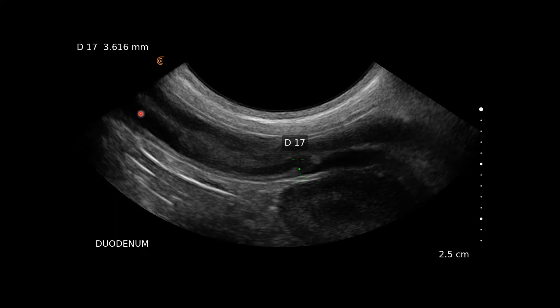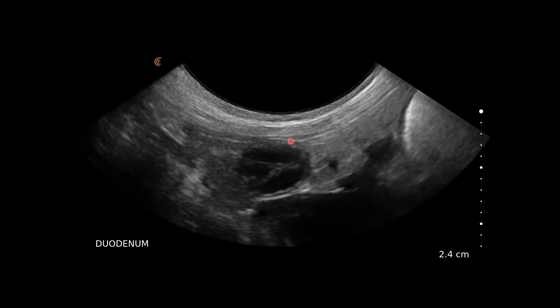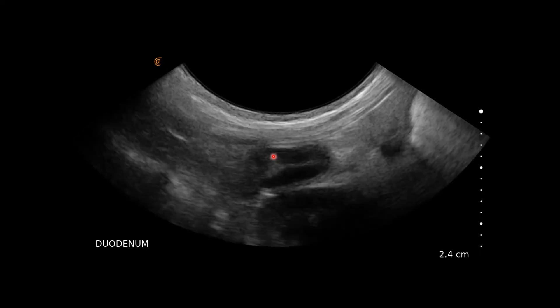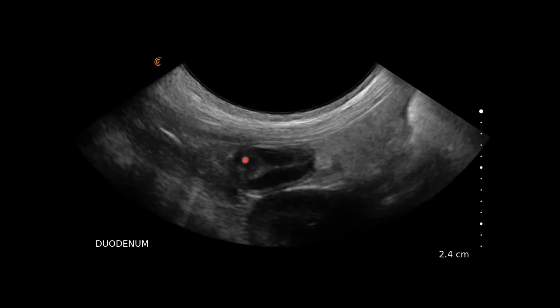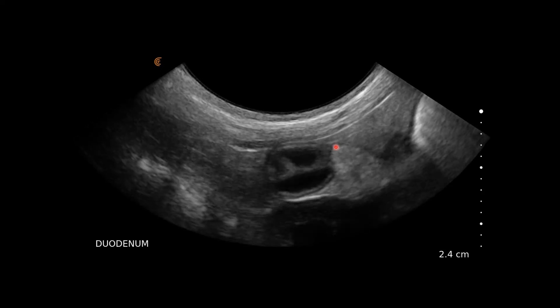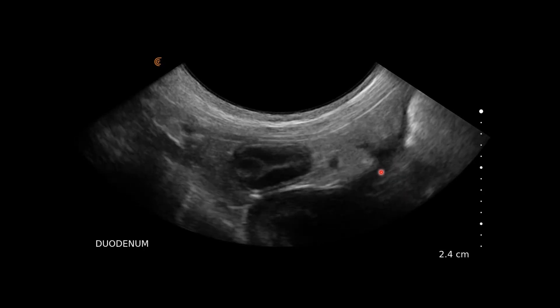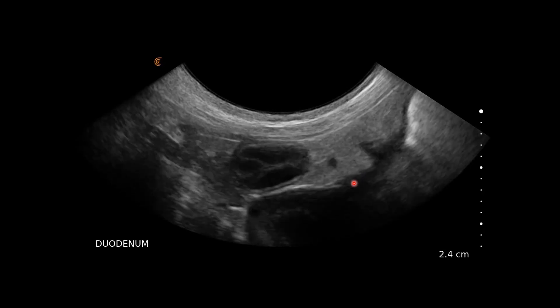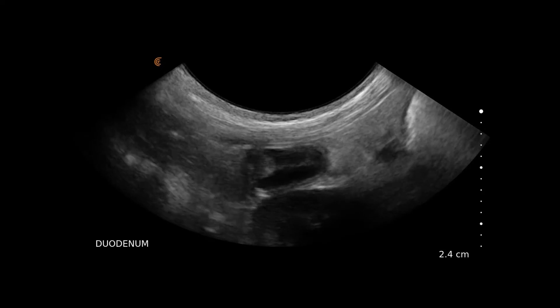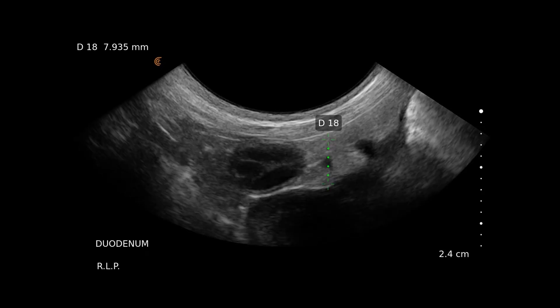The duodenum: we've got a nice straight loop of intestine that is very superficial, very close to the body wall. Measuring a nice normal thickness and the wall layers looking normal. In transverse, the duodenum shows the lumen in the middle, then mucosa on both sides, submucosa, thin muscularis, and thin serosa. On the side of the duodenum we can see a triangular structure — highlighted because there is free fluid in the abdomen — and this is actually the right limb of the pancreas floating around in the ascites. Measuring the right limb of the pancreas, we can also see the anechoic tube running through it, which is the pancreaticoduodenal vein.